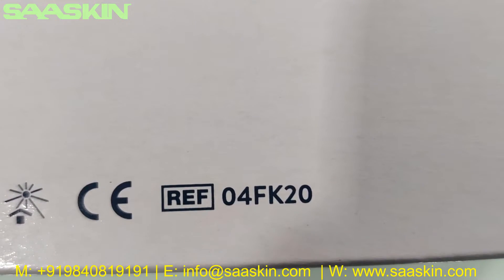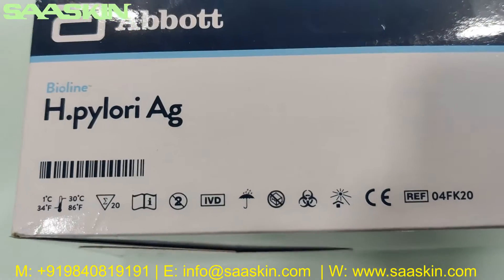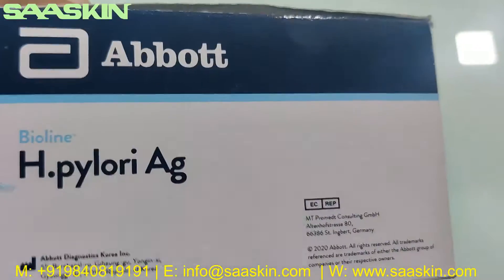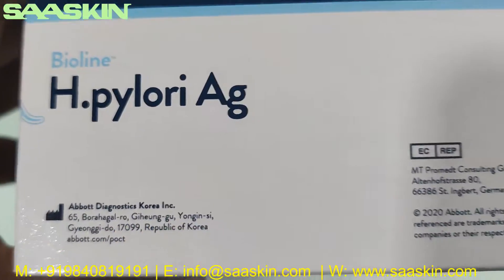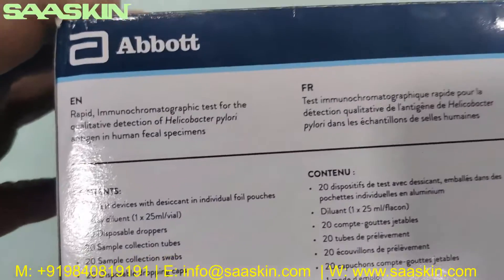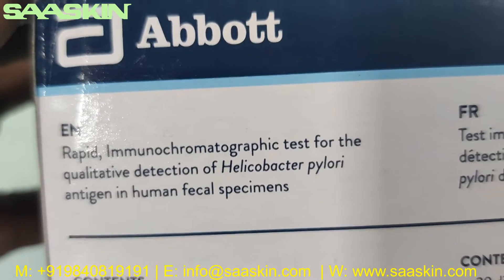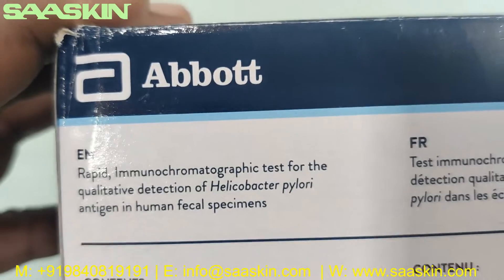This is the reference part number 04FK20. This is a certified product. You can see it can be maintained at normal room temperature. This is a 20 test kit box, RBD certified. You can see this is manufactured in Korea. It says rapid immunochromatographic test for the qualitative detection of Helicobacter pylori antigen in human fecal specimens.